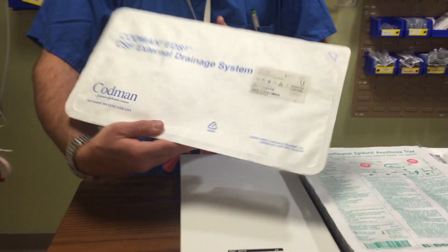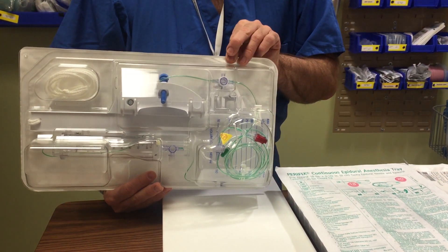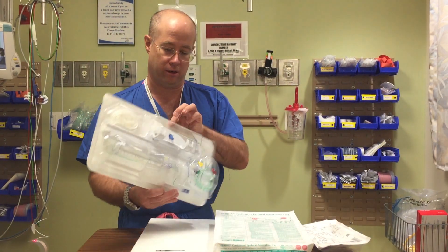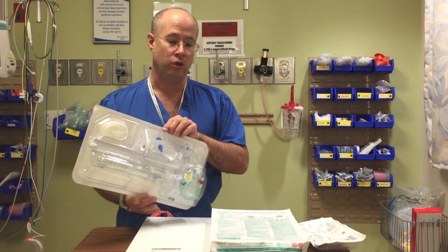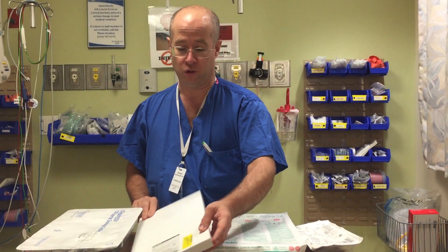To place a lumbar drain in the operating room, you need four major items from the stock room. You need the drainage system — we use the system made by Codman here. You need the tray that contains the actual drainage catheter — we use this version from Medtronic. Usually the catheter and the drainage system are stocked right next to each other. These items don't contain things like a sterile drape or lidocaine, so we usually open a standard epidural tray just to give us these additional items.